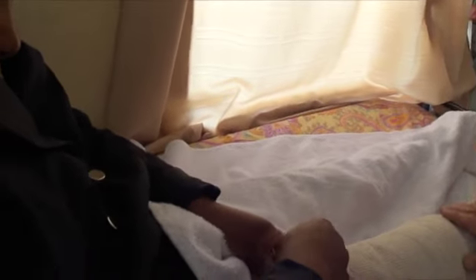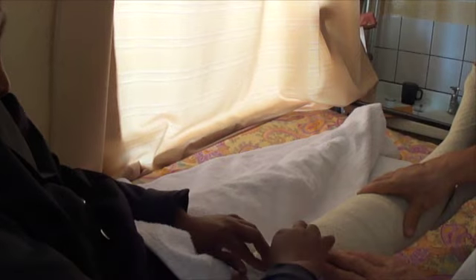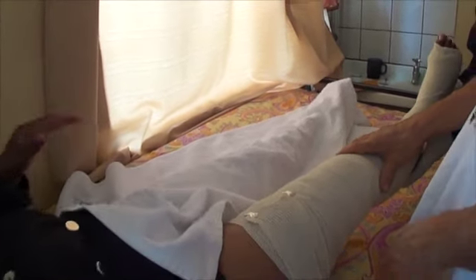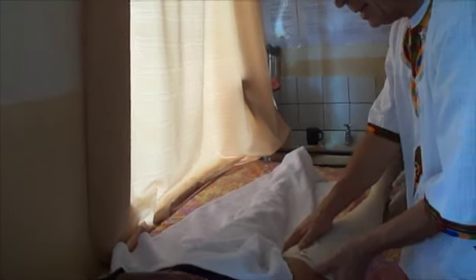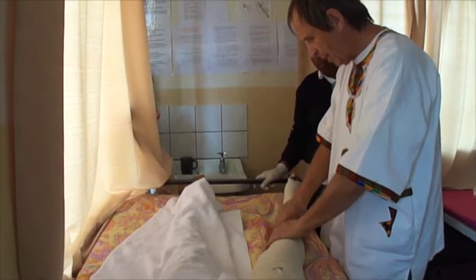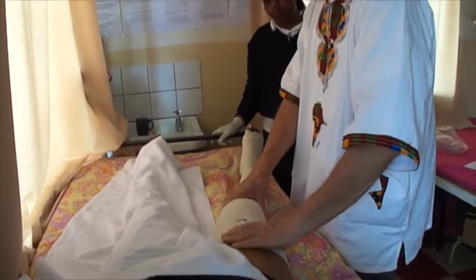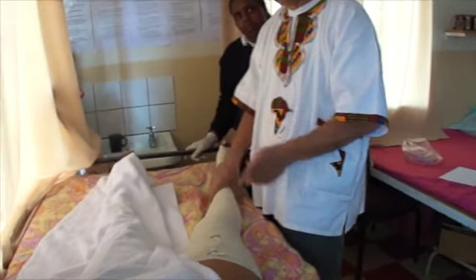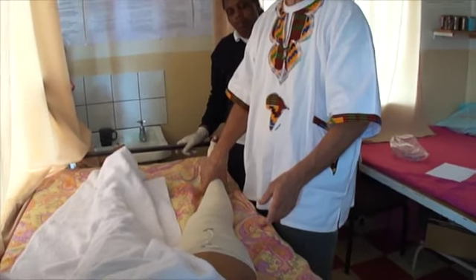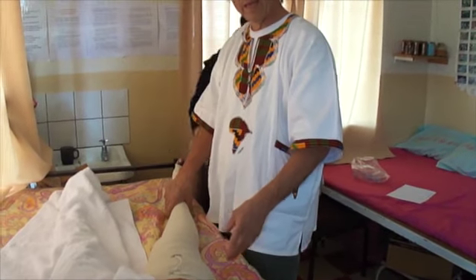We teach the patient to do it by himself. I can assess and feel how the pressure is. If I feel that there is a bulge coming out, maybe there is more pressure there and I have to undo it and try again. But don't worry — if you are a beginner, you won't succeed immediately perfectly. If it is quite good, be happy. Over time, as you do it again, it will become better.